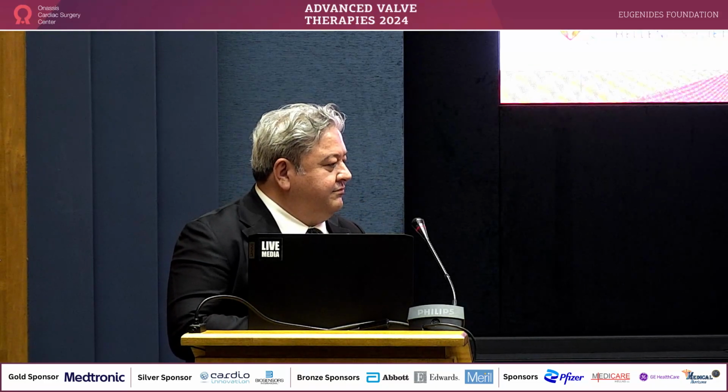Excellent presentation. You don't need to show the live case. You saw the cases, 3 cases. And can I ask you a question practically? When you do the loop, which wire do you leave? The Terumo wire? Because sometimes, you know, it distorts the position of the device. Which wire do you use for the loop? I always use the Terumo guide.